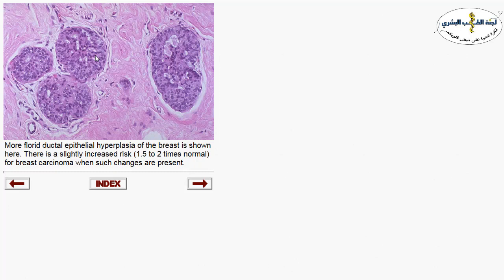One of the components of fibrocystic changes is usual ductal hyperplasia (UDH). The breast is composed of lobules, glands, and ducts. You can see proliferation in the epithelial lining — benign proliferation — called usual ductal hyperplasia, defined as more than two cell layers. Normally we have inner luminal cells and outer myoepithelial cells. When we see benign proliferation in the luminal lining with no atypia or dysplastic changes, this represents UDH, one component of fibrocystic changes. Hyperplasia carries a risk of 1.5 to 2 times normal for breast carcinoma.